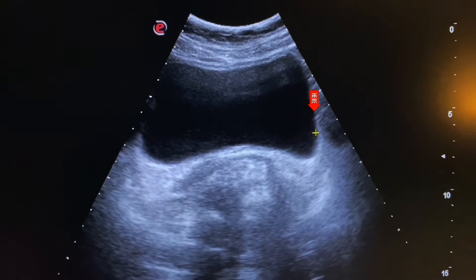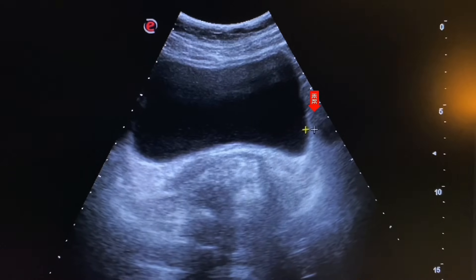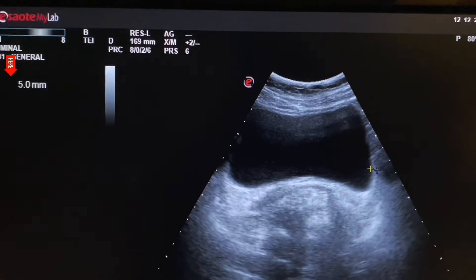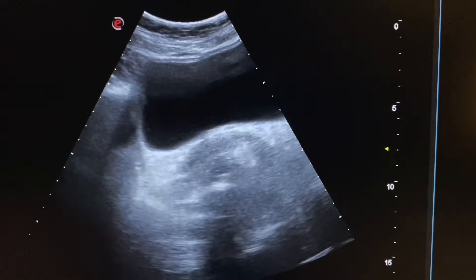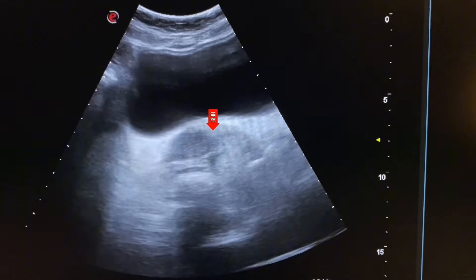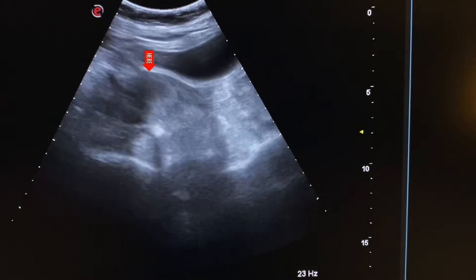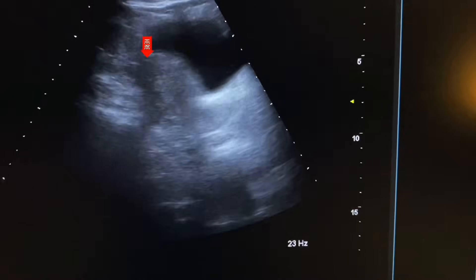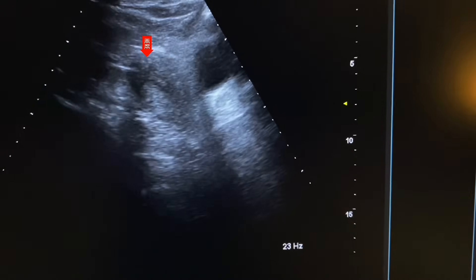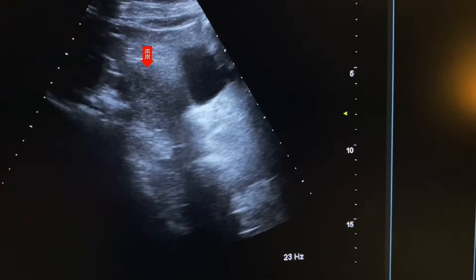Now we will measure the size of the urinary bladder wall. The wall thickness is 5 mm, which appears to be normal. This is the rectum, which contains gas, fecal matter, and fluid. This is the uterus. Here we see the endometrium, which appears as a thin line. Postmenopausal endometrium size should be less than 5 mm.